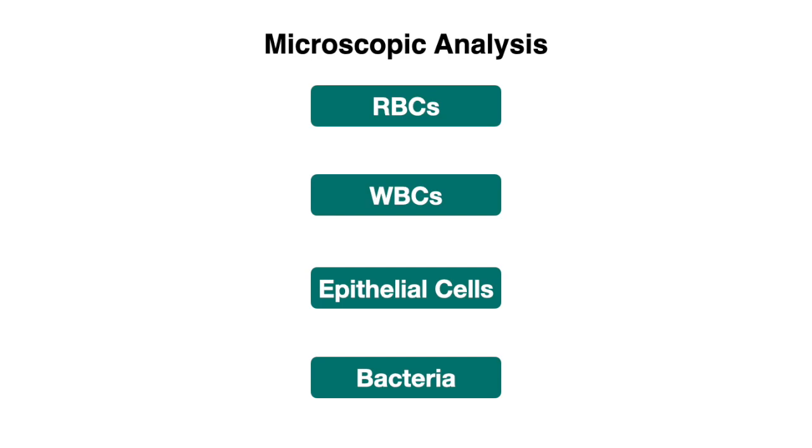So let's start with our first scenario that we just discussed, which is where you have hematuria on dipstick and you obtained a microscopy to confirm. If you see 3 or more RBCs per high power field on microscopy, this is confirmatory for microhematuria. And once you've confirmed microhematuria, the risk of a GU or a genitourinary malignancy is 3% in these patients.